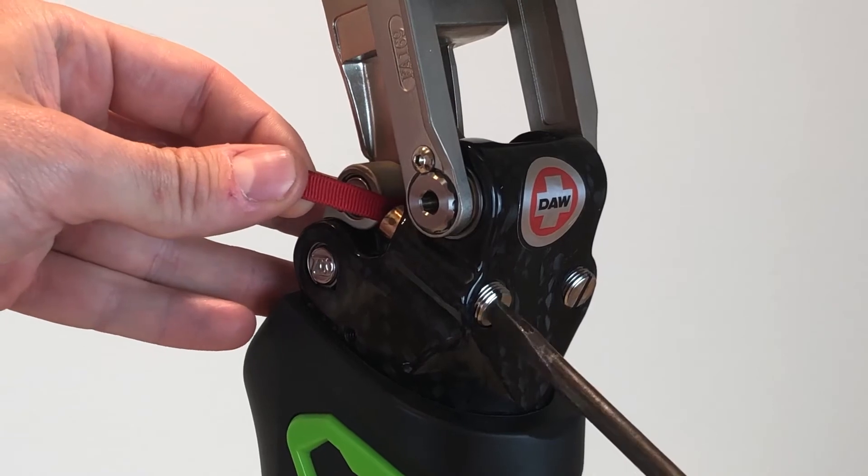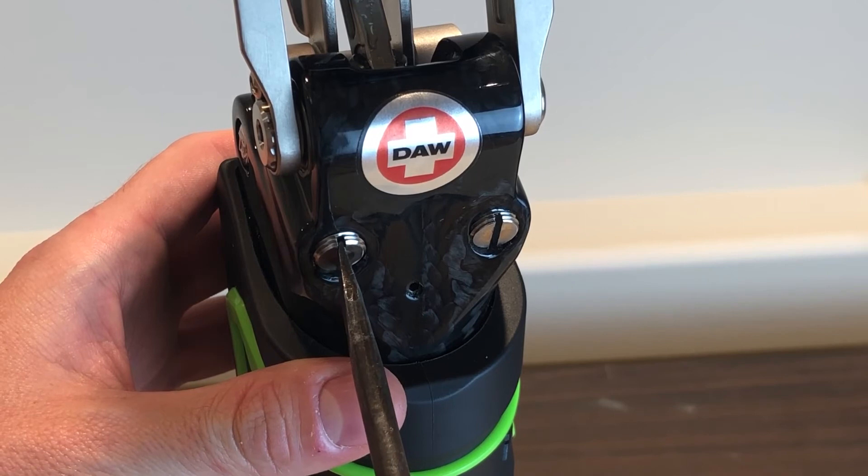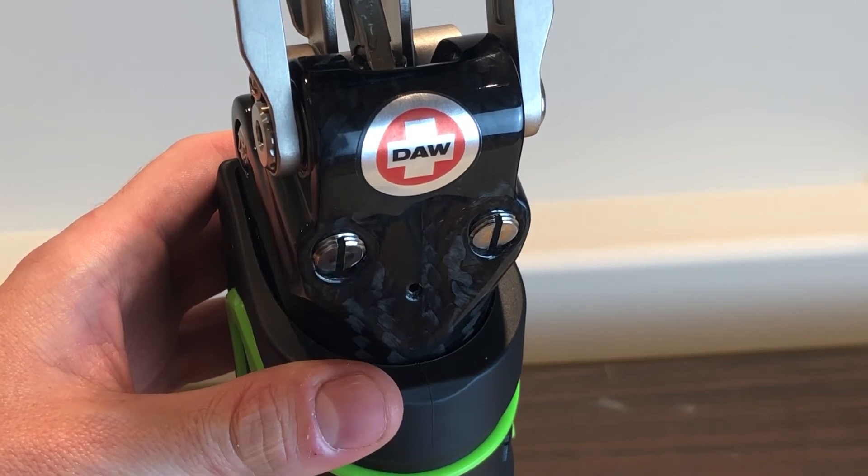Make sure the screws have been adjusted equally by verifying each screw slit faces in the same direction and the same number of threads are showing.